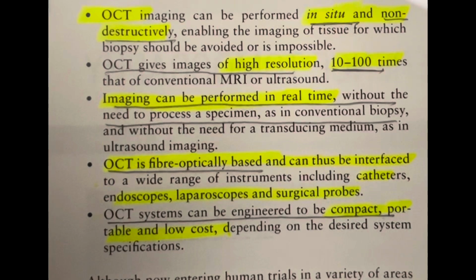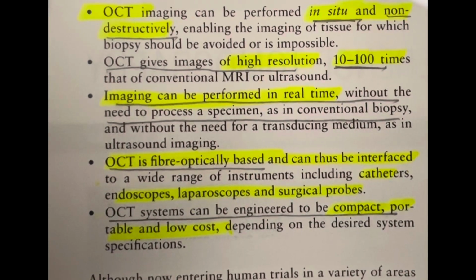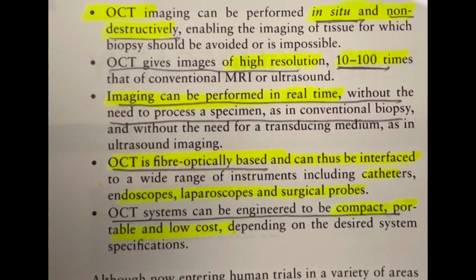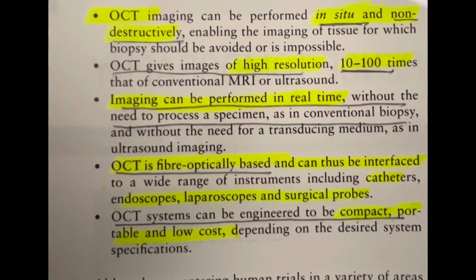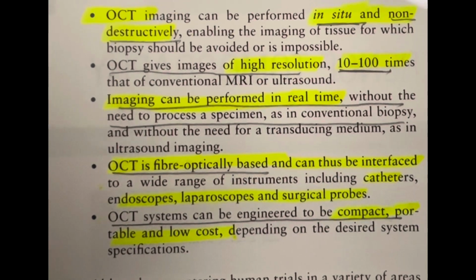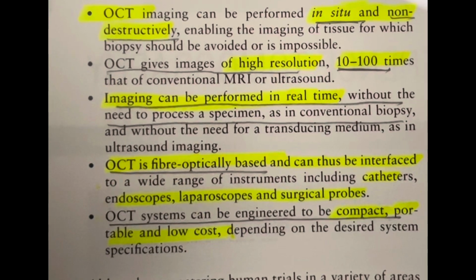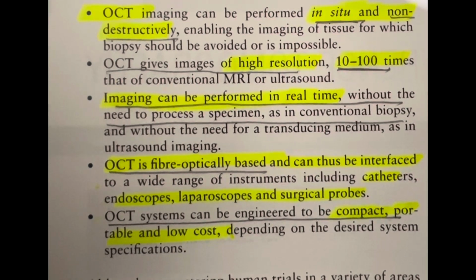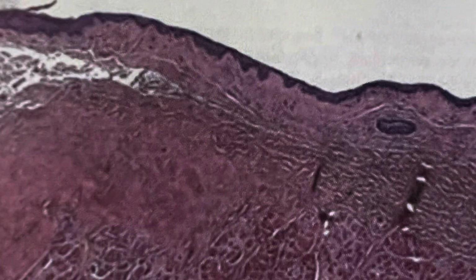Imaging can be performed in real time, without the need to process a specimen as in conventional biopsy, and without the need for a transducing medium as in ultrasound imaging. OCT is fiber optically based and can be attached to a catheter, endoscope, laparoscope or surgical probes. An OCT system can be engineered to be compact, portable and low cost, depending on the desired system specification.